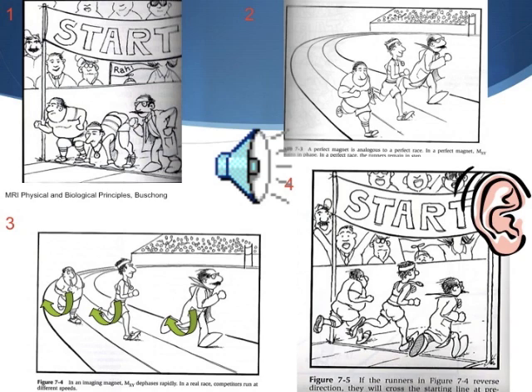The signal is only as powerful as the number of protons that are in line with each other during the echo collection. So the purpose of the rephasing pulse is to get the different protons, quote, in phase with each other, so that when you choose to listen to your signal, which is your echo time, you have as many in phase with each other as possible to add to the signal collection.